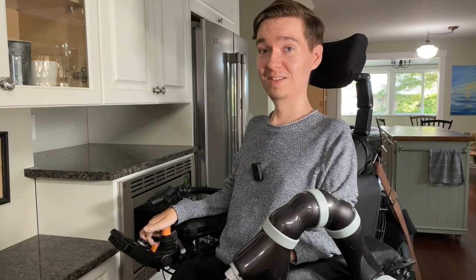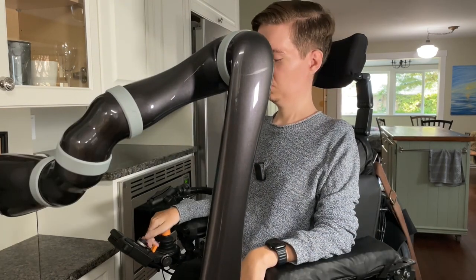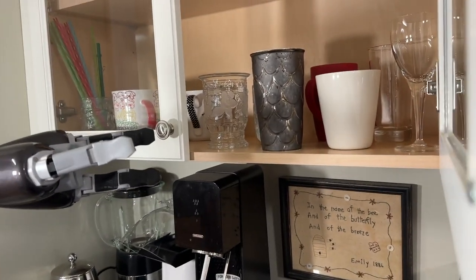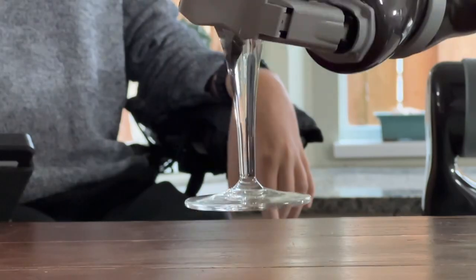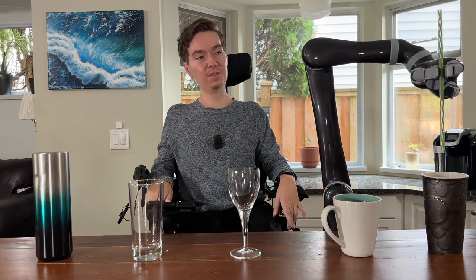The first thing we need is a cup. I've laid out five different cups here in a variety of shapes, sizes, and styles to demonstrate that your cups at home will work no matter what they look like. Using Jayco with a straw is also entirely possible and is my personal preference, but the option is up to you of course.